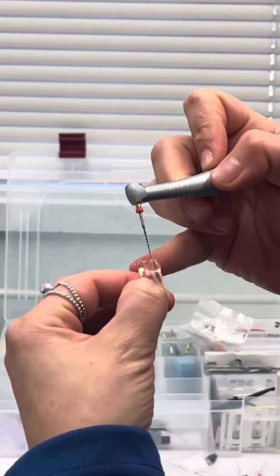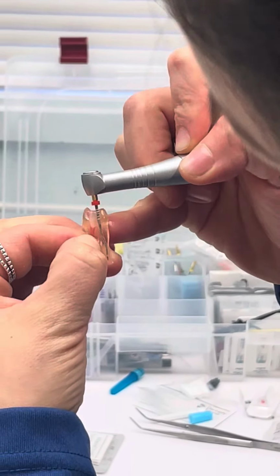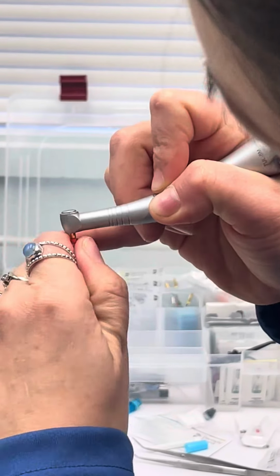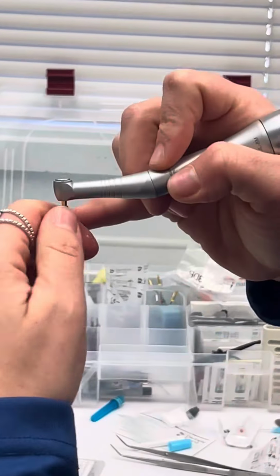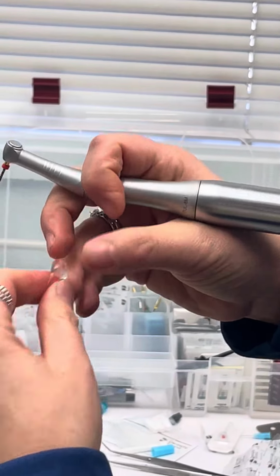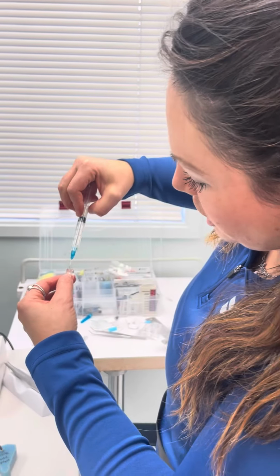Oh. So slippery. I just went past my apex too. Let's get out of here. Okay, alrighty, so I just went past my apex just now, so I'm not going to file anymore, for the sake of fitting the cone right now.